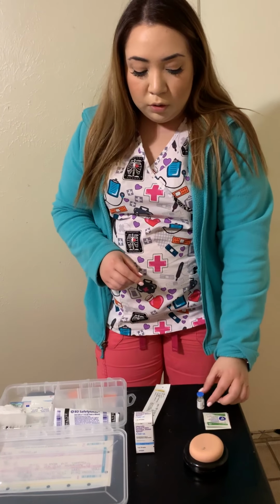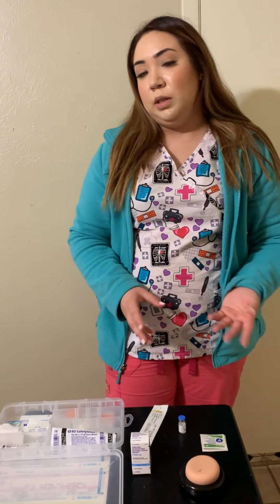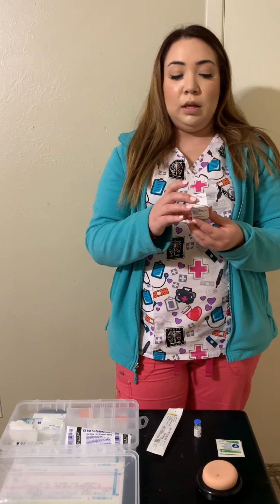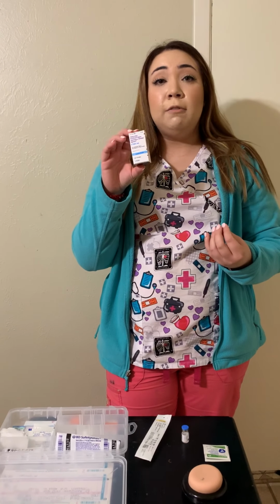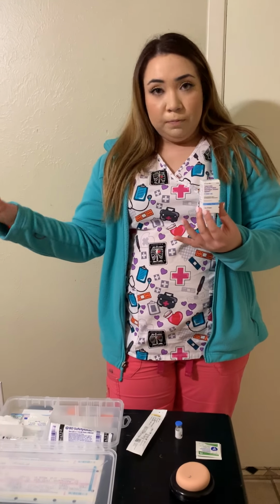We have our alcohol pads, and of course our vial with medication, or not medication, but a solution. The solution that the vial contains is a purified protein derivative, meaning it is similar to the actual strain of TB, and it's not going to infect the person. It is just going to help us determine whether or not the person's skin has a reaction to it, which again determines the positive or negative testing.